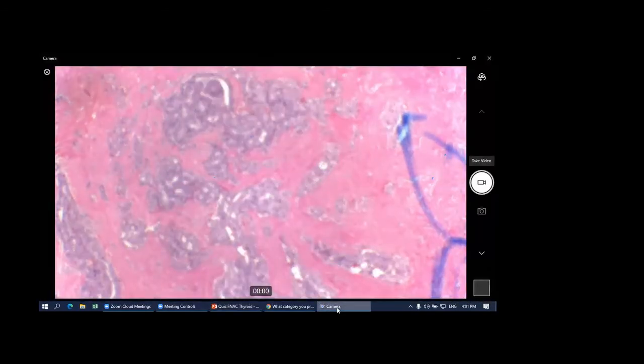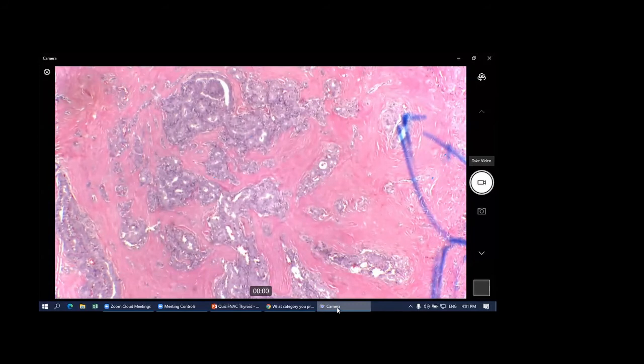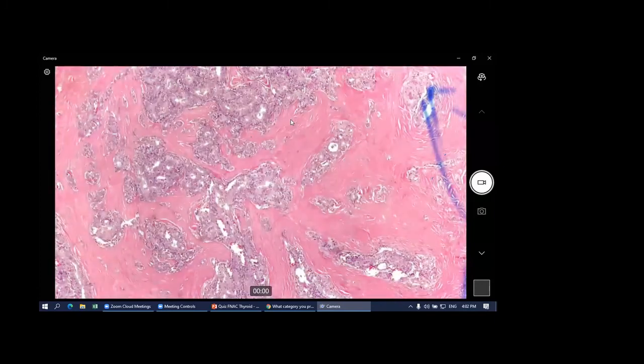But just to show you guys, this is the histology. Can you see that? Okay. I'm a bit surprised that somehow or other, the radiologist's needle did manage to reach this area. Because mind you, this is the lower power. The size of the tumor is actually quite small.